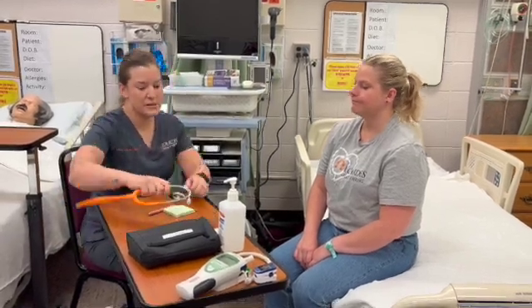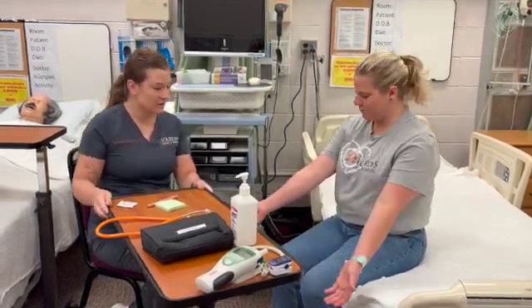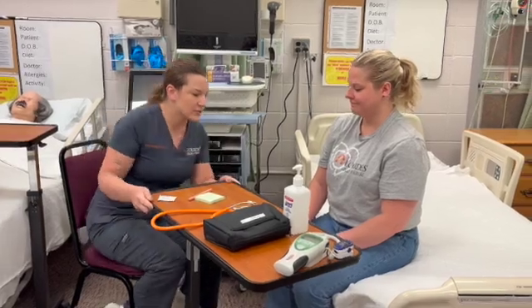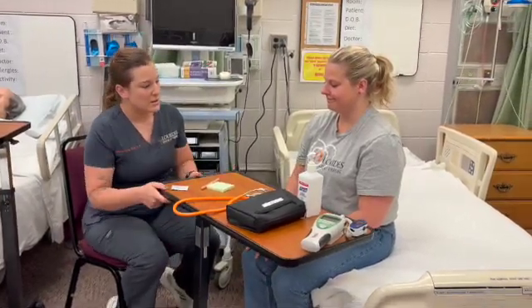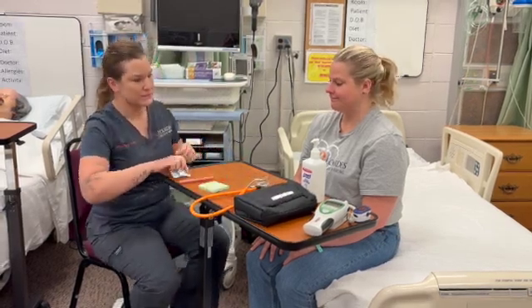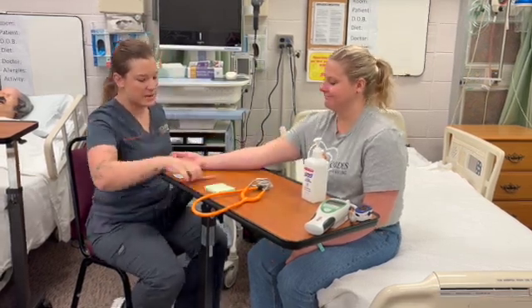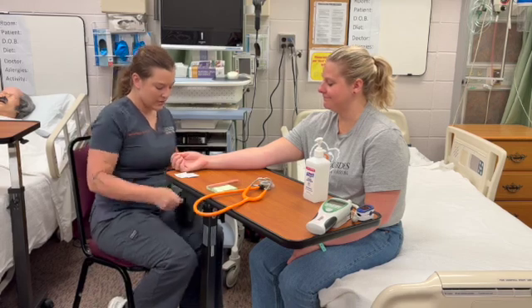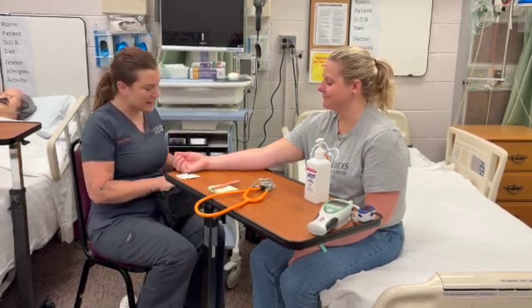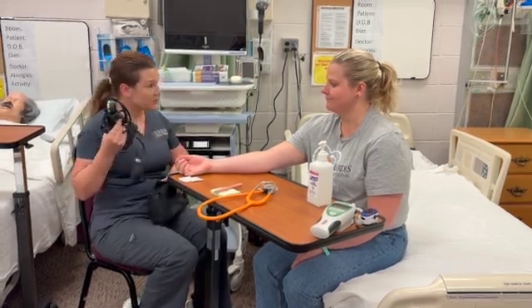I'm just going to check your blood pressure first. Do you have any history of a mastectomy? No. No fistulas? No. And no IVs in your arm, it looks like? No. Perfect. I did perform hand hygiene. If I needed to, I would put on some gloves, but if you're comfortable with it, I'm not going to use gloves.